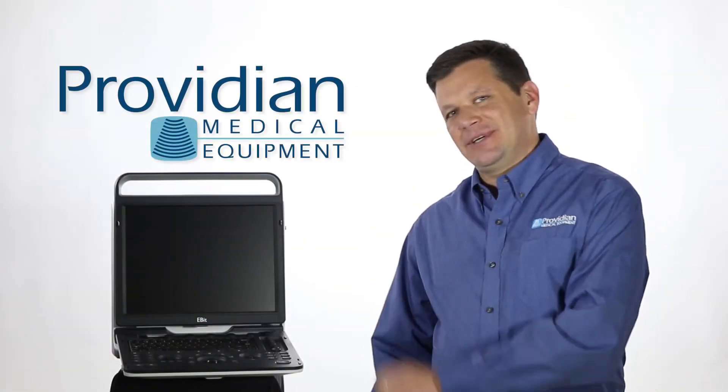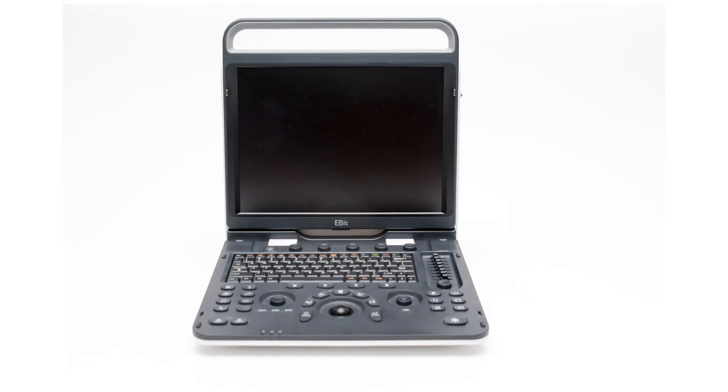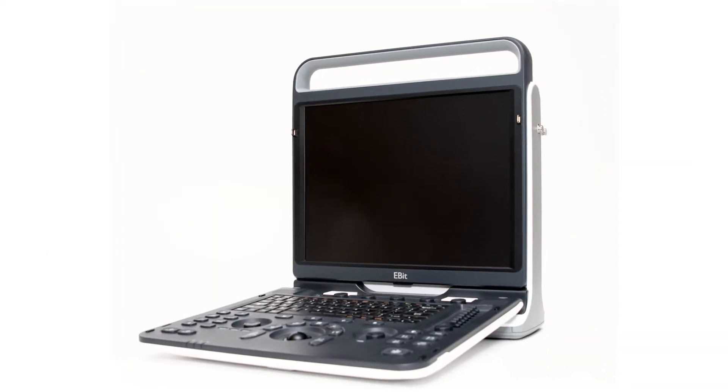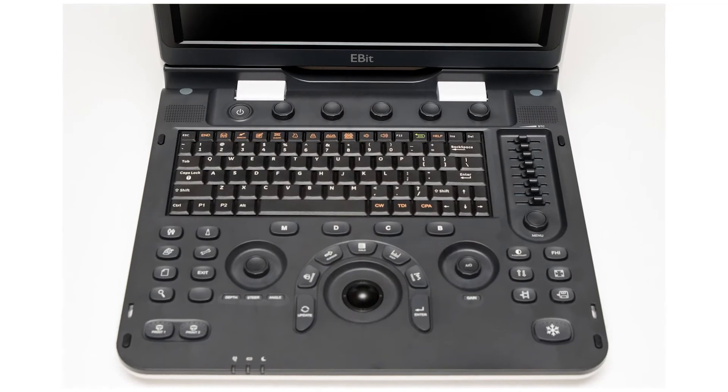I'm Brian Gill with Providian Medical, and today I'm introducing the Chison EBIT 60 — a portable shared service ultrasound machine that provides very good image quality without breaking your bank.